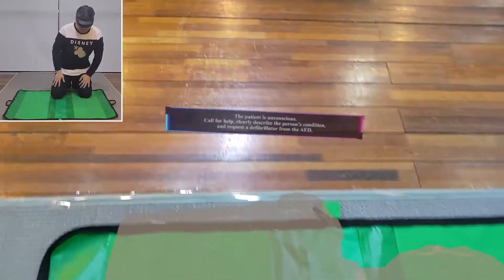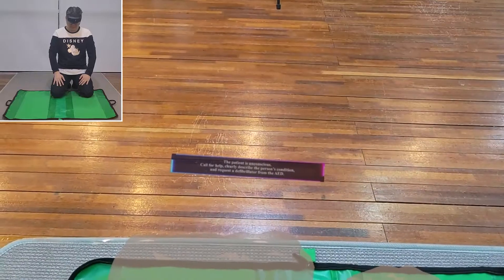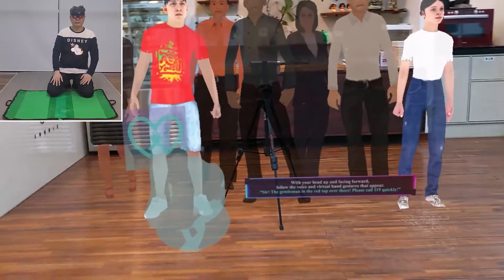The patient is unconscious. Call for help, clearly describe the person's condition, and request a defibrillator from the AED. With your head up and facing forward, follow the voice and virtual hand gestures that appear.